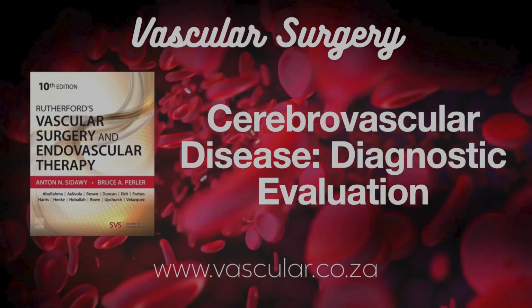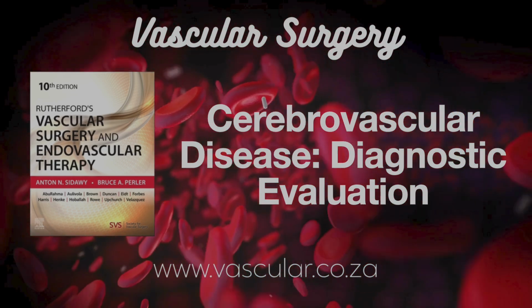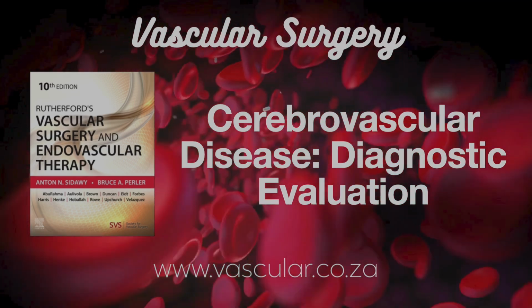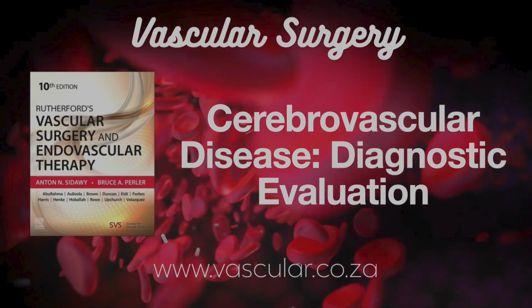Okay, looking ahead now, what's exciting? What are the future directions in carotid imaging? A really big focus now is shifting from just measuring how narrow the artery is to evaluating the plaque itself. What is it made of? Is it stable or unstable? Getting beyond just the percentage stenosis.